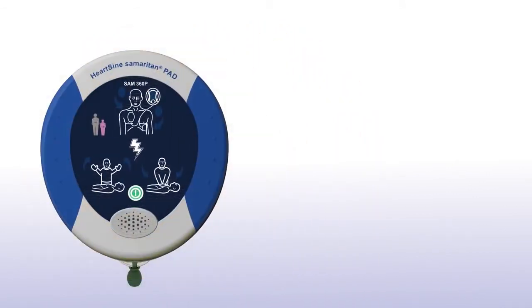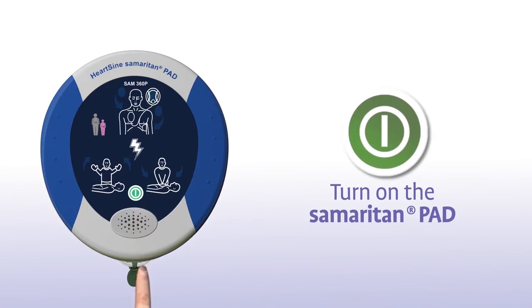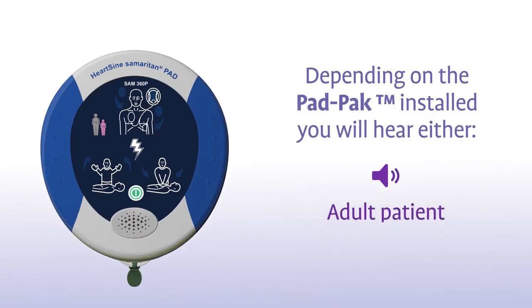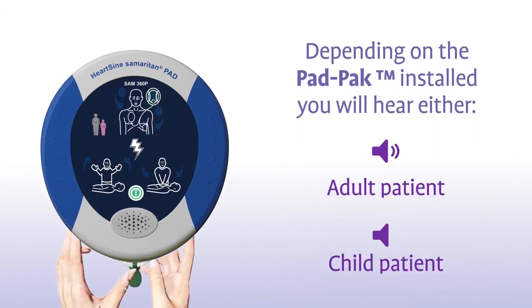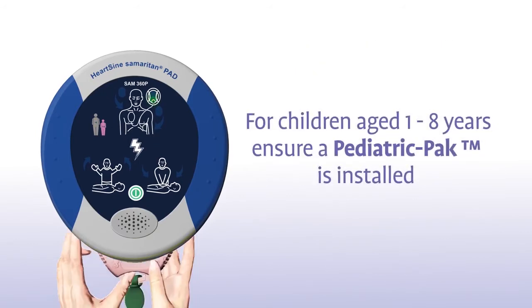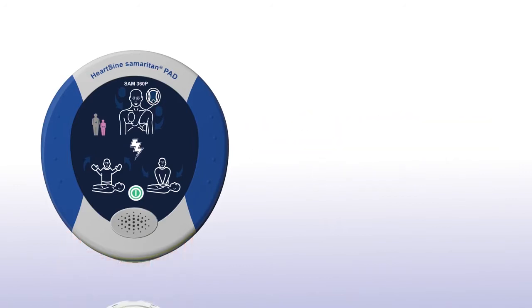Press the green on-off button to turn on the Samaritan PAD. Depending on the pad pack currently installed, you will hear either an adult patient or a child patient prompt. If the patient is a child between 1 and 8 years of age, you should ensure a pink paediatric pack is installed. If a pink paediatric pack is not available, you may use the grey adult pad pack instead.